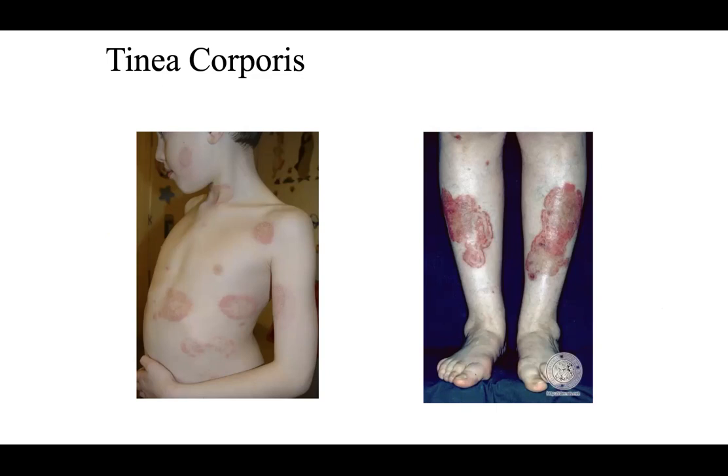It can be difficult sometimes to know if you're dealing with a subacute cutaneous lupus, or even a granuloma annulare can sometimes look like this. Erythema annulare centrifugum. These are all reasonable suspicions. Even here, this erythema gyratum repens can look very similar to this picture over here. So biopsy is going to be key to really establish the diagnosis.